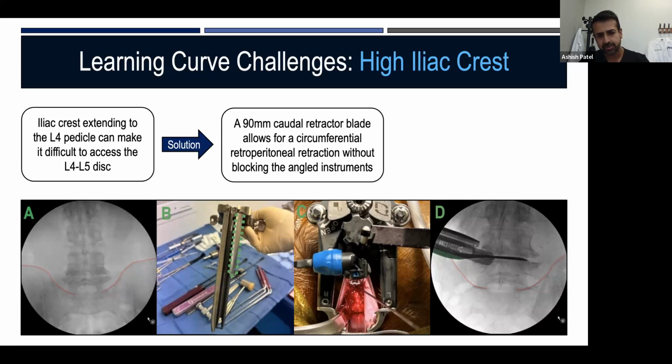They work outside of the retractor blade, so they're not hidden up against the retractor, because if they are, they cause the retractor to pull out. So we were able to navigate a high crest by using this little trick combined with the glove trick.